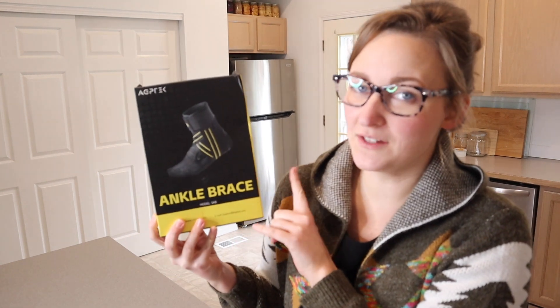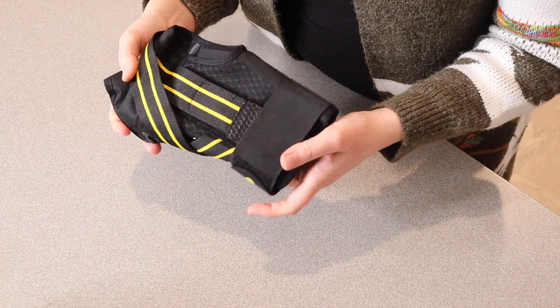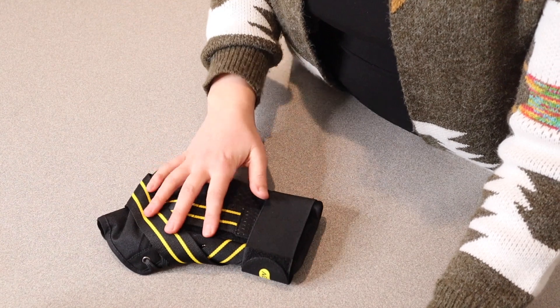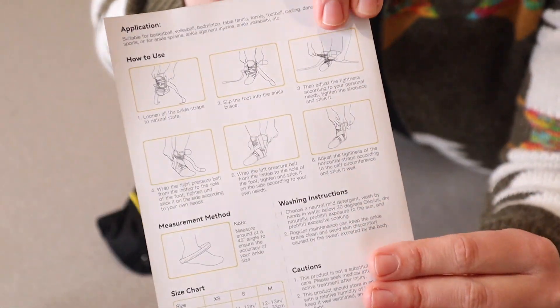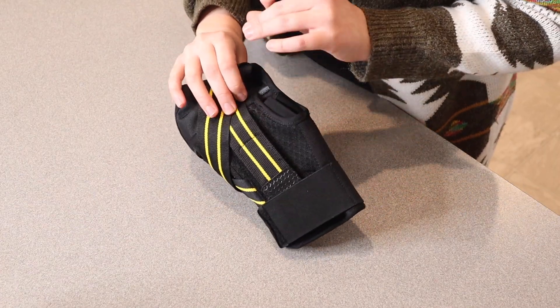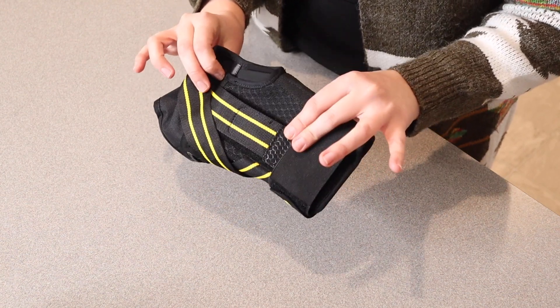Right here I have this ankle brace. Let me go ahead and open this up and show you what it looks like and how to use it. Besides the user manual, this ankle brace was everything that came inside the package. I do want to note that the user manual shows pictures on how to wear this correctly, which I really like. There are also different sizes, so you want to make sure that you measure to get the right size to fit your foot.